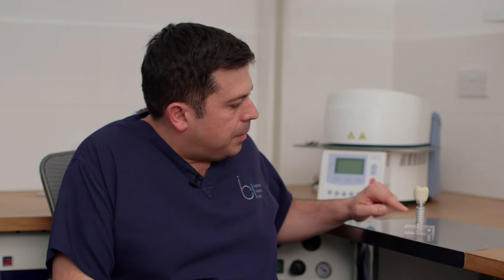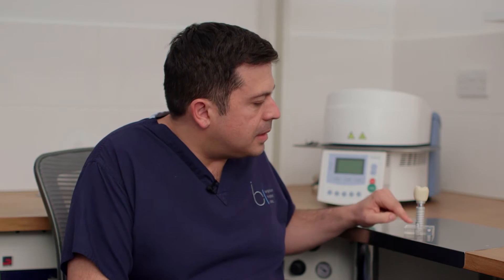This model that we have over here is of a typical implant. Essentially there are two main parts that make up an implant. This part at the bottom, which is what the dentist will refer to as the implant, it looks like a screw. It's made out of titanium and this part is placed into the jaw bone, and it needs about three to four months for it to integrate fully with the bone tissue.